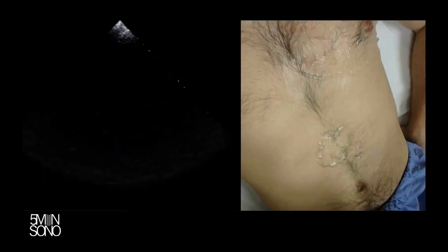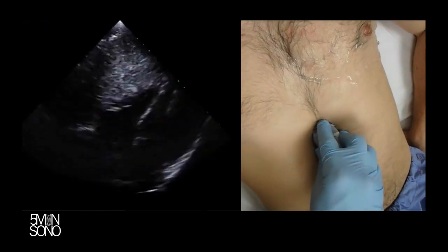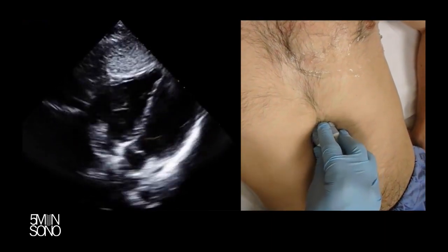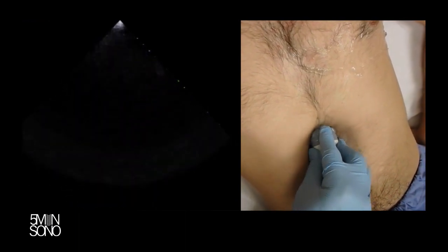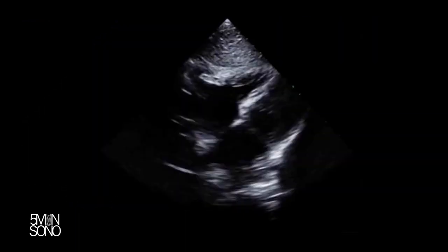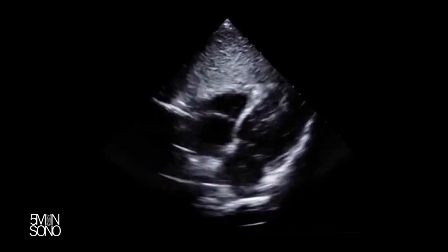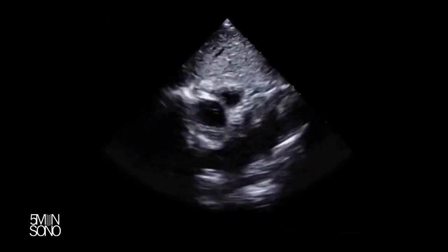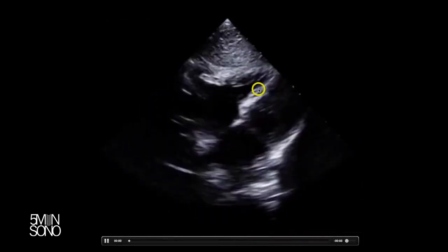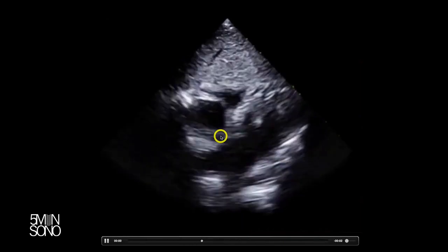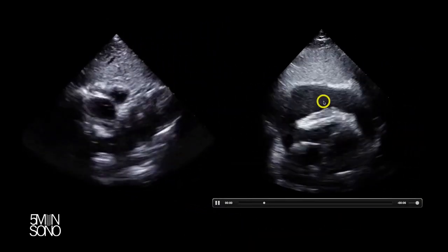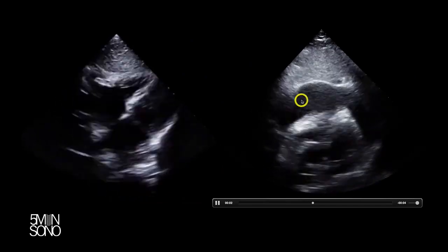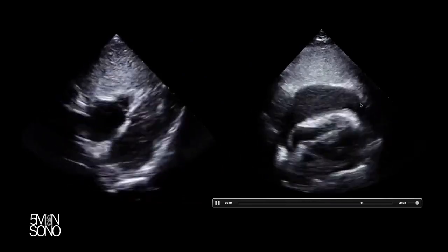Now let's talk about evaluating the thorax. For this, we're usually going to do a sub-xiphoid view of the heart, and what we're looking for is the presence of fluid around the heart. Here is a normal heart — no rim of black around it. Compare that to this example where you see all of this black surrounding the heart — this is what a pericardial effusion looks like.